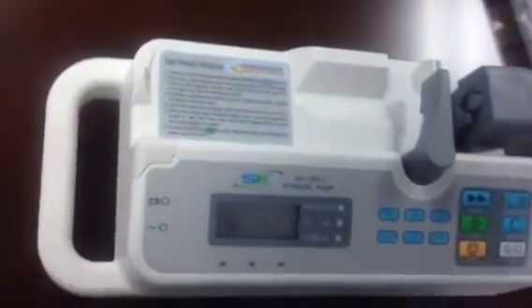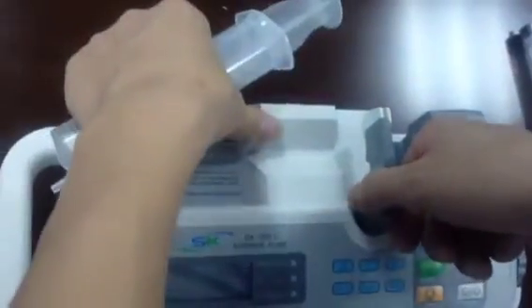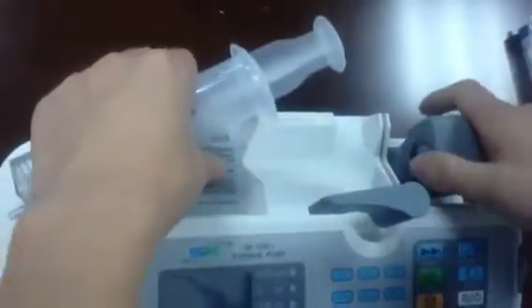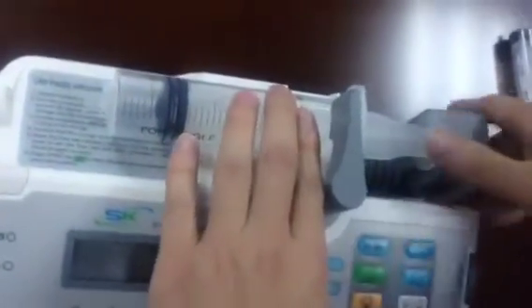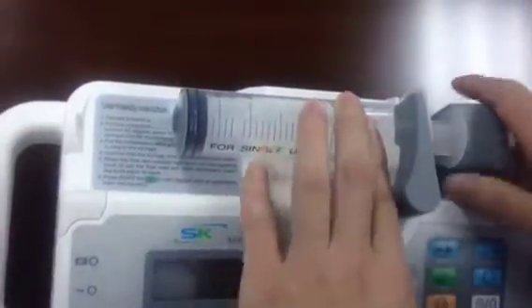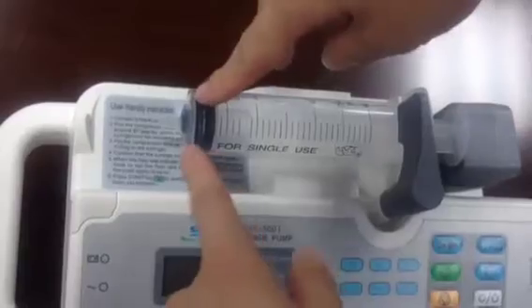The next step: install the syringe. Pull out the holder lever and install the syringe. Then press the button to move the compression structure.